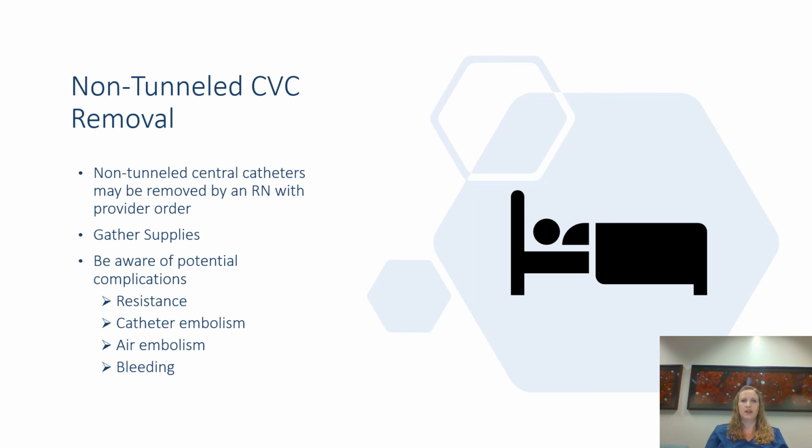Some of those complications include resistance. If you're feeling resistance when you're attempting to remove that catheter, stop and notify the provider. You don't want to continue to pull when you're feeling that resistance.